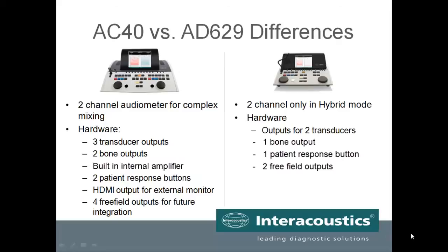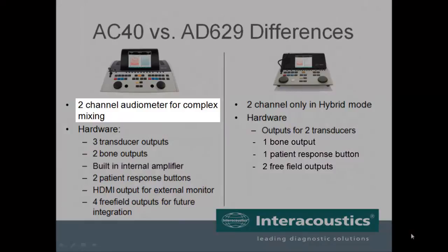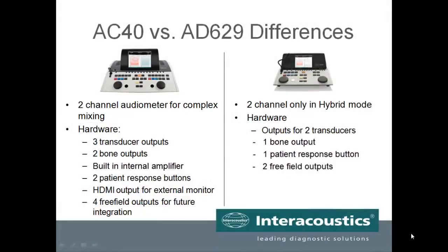With so many similarities between these two models, it is important to note the differences. The differences are specific to the hardware as well as the testing capabilities. The AC40 allows for two-channel audiometry where complex mixing of stimuli is presented within one channel. This functionality is available in the AC40 standalone product as well as the hybrid version.